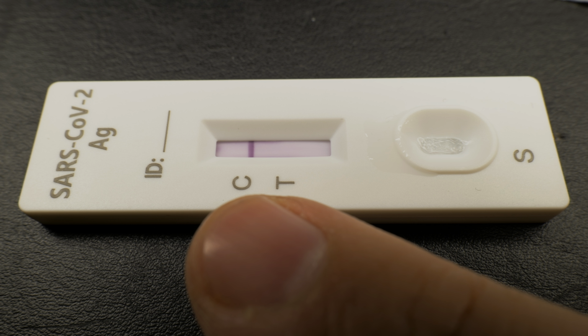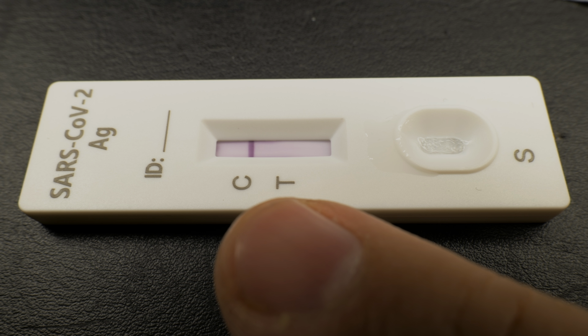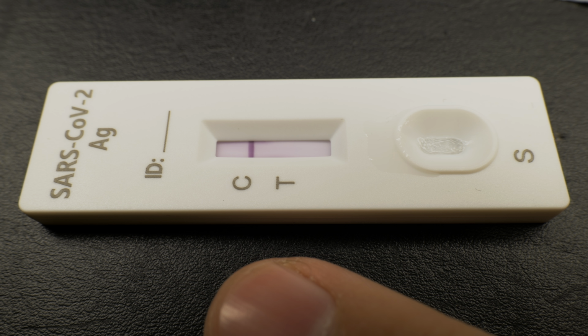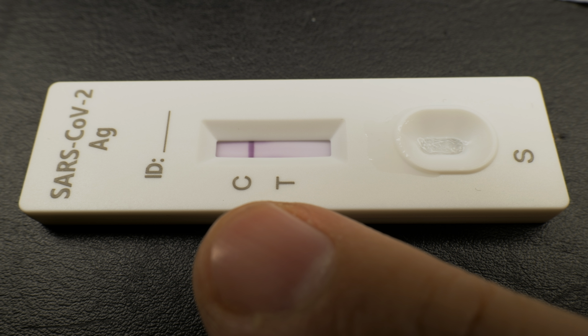If you have one line here and another line here, 2 lines in total, that's a positive result, and you have to talk to your medical provider. This is not medical advice. I'm just showing you how I do my test. Your test might be different. If you're not sure, ask your medical provider or your doctor or the pharmacy where you bought this test from.